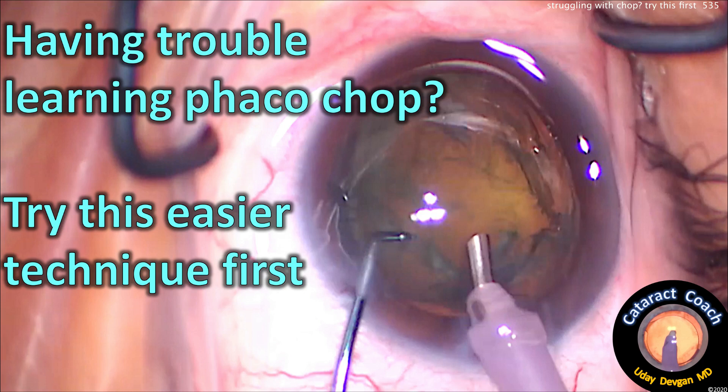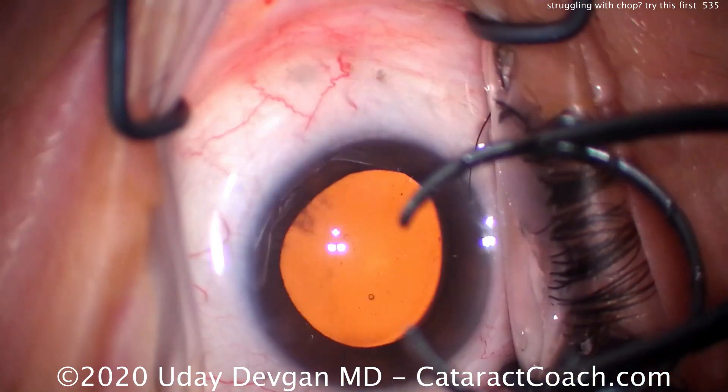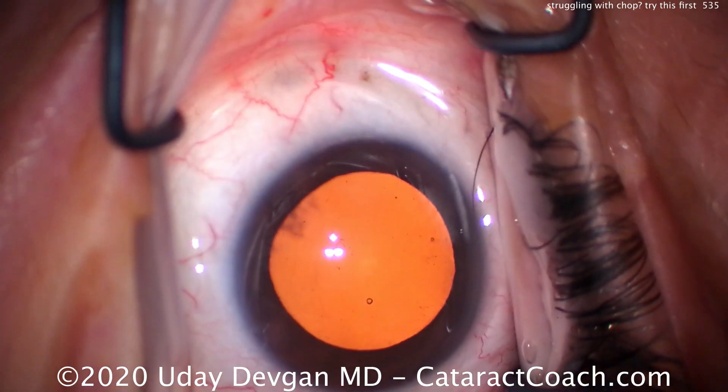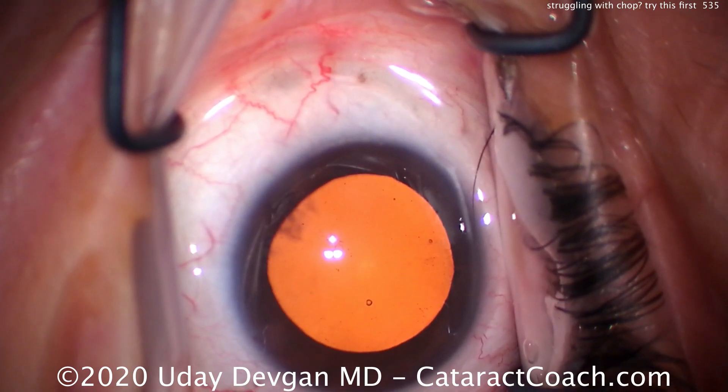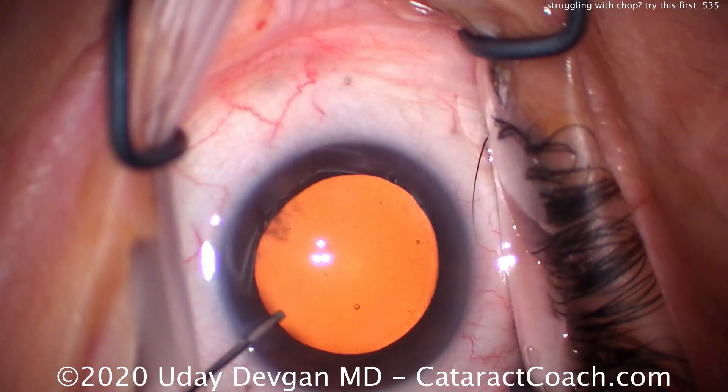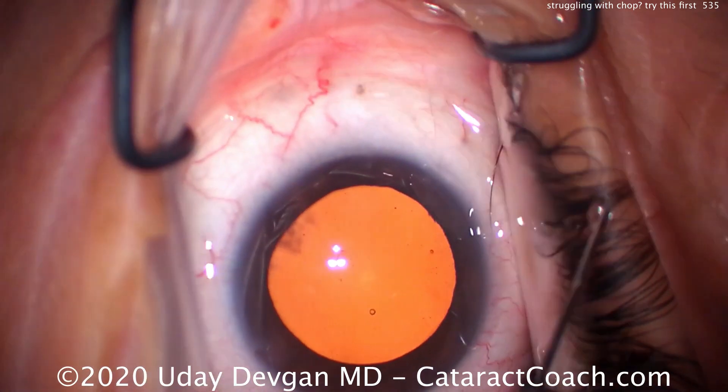CataractCoach.com. Are you having trouble learning FACOCHOP? Try this easier technique first. A lot of surgeons have emailed me saying they're having a lot of trouble learning FACOCHOP. And it's a challenge. The biggest challenge in FACOCHOP is there's a finite window of time in which you must accomplish the chop.